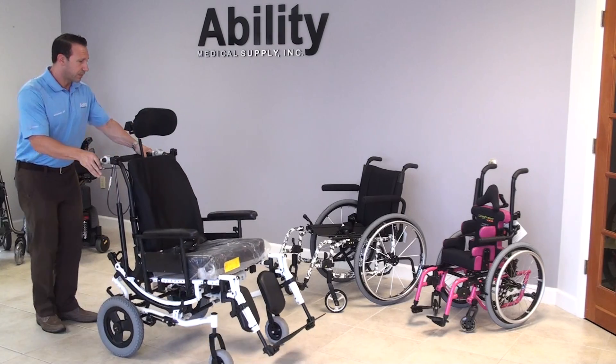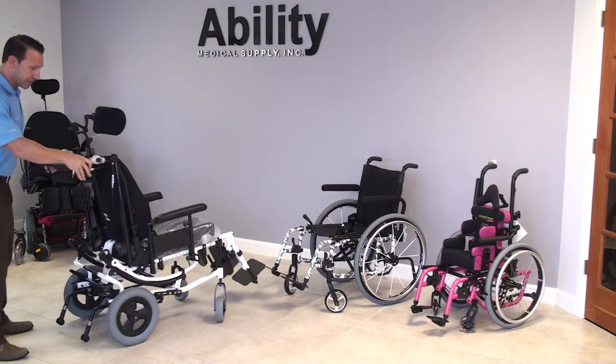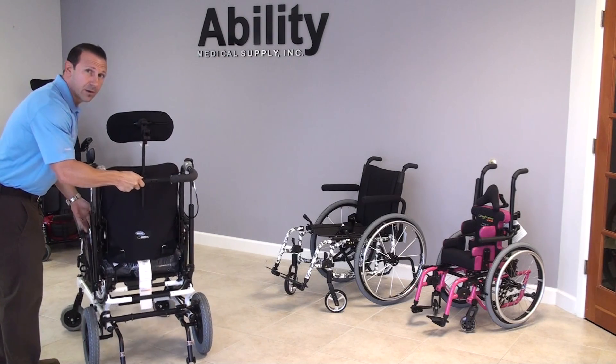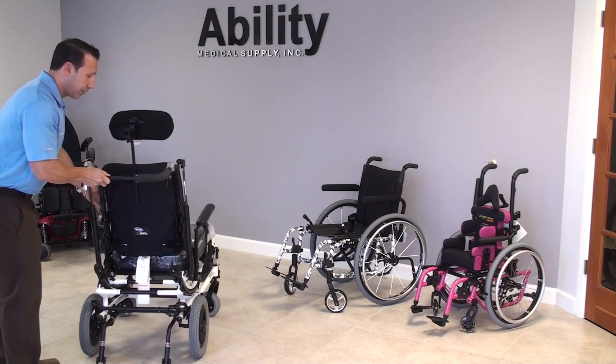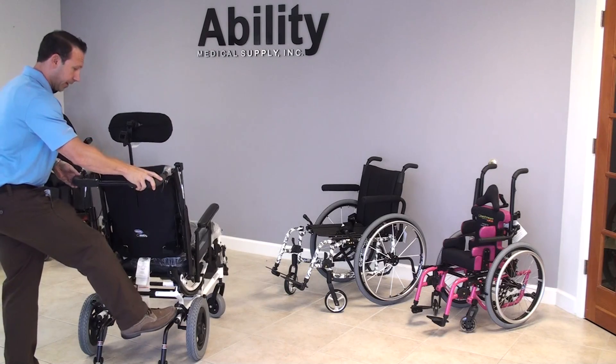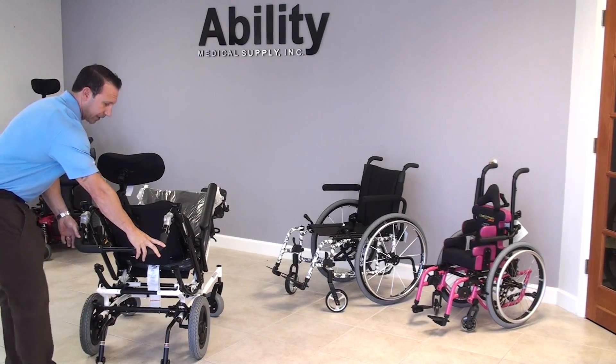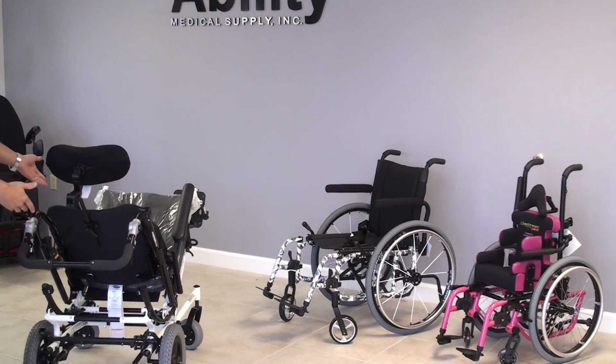I'm going to show you how that works, but first I want to show you the new technology here. This is a cable-free, foot-operated tilt mechanism. All you have to do is push with your foot and the chair tilts back to whichever angle you prefer. You release your foot and the system locks in.